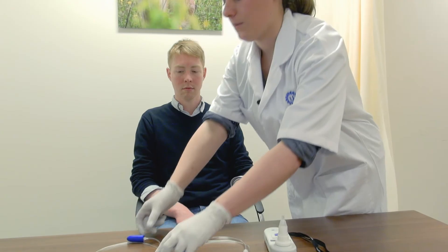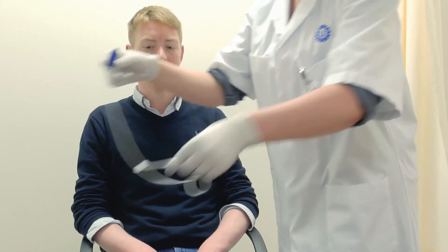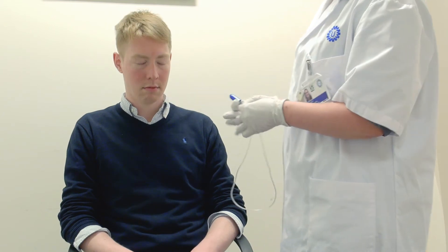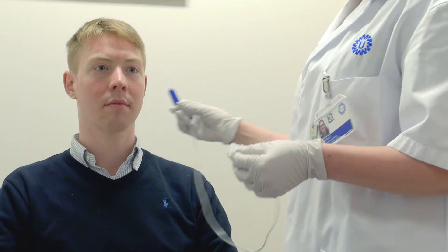First, we're going to find a nasal probe that fits you comfortably. This one is too big. This one seems to fit. Perfect. Now, one at a time, I want you to close one of your nostrils and take an inhale and an exhale. Let me know which nostril seems to feel like it takes in the most air. Which nostril seems to take in the most air? The left one. We'll put the probe in your left nostril.